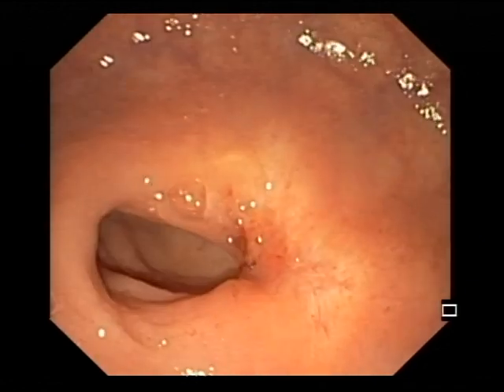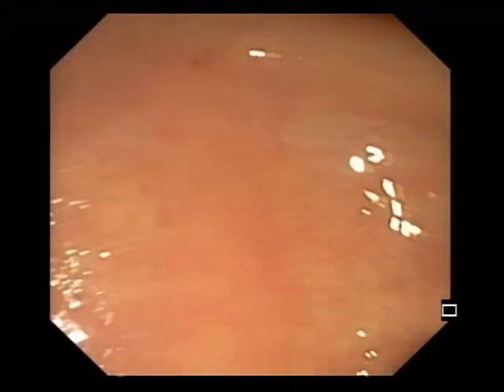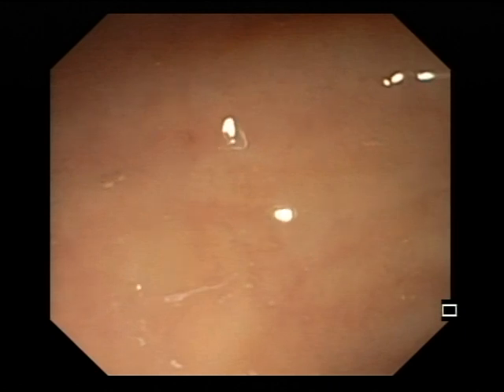Another thing is, whenever you do a rectal EUS, please make a habit of doing an endoscopic view first. I usually use an EGD scope for that purpose, a flexible scope, first before I use the EUS scope. So here it's okay. We got a nice view of that. I'm going to try to see if I can get a little further in there.